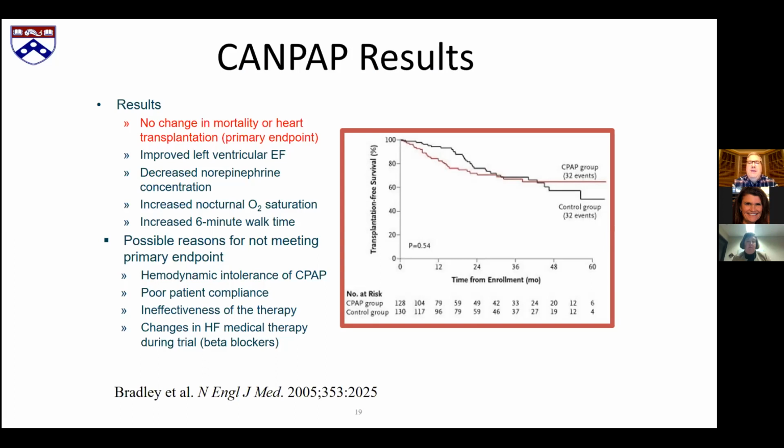And I have to say, having done some research in this field, we were pretty disappointed by this finding, but not totally surprised. One of the reasons why we were not totally surprised is because the clinical experience was that a lot of these patients who required relatively high pressure CPAP really were uncomfortable and struggled to tolerate it. And so the compliance was not so great.